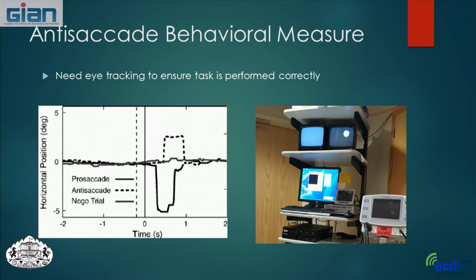We also have the eye tracking system, which actually looks at their pupil and their corneal reflection. And this monitor system up here is actually the person's eye. So we can see it pretty well and see if it's open or closed and see what it's moving around doing. The thing below it is a better indicator to us as to whether their eye is moving back and forth, up and down. You can sort of track what they're looking at there.